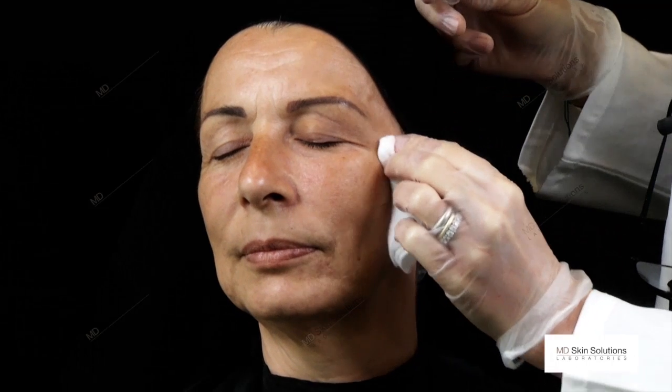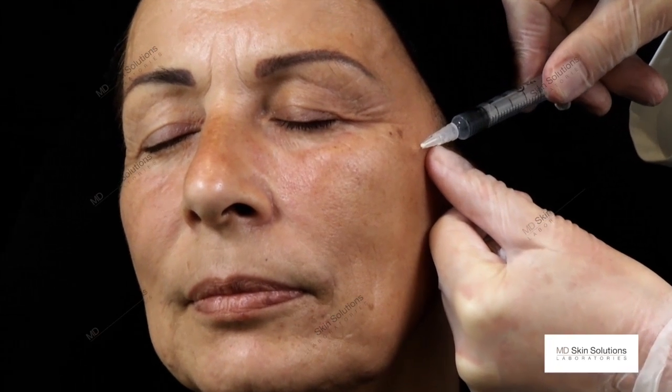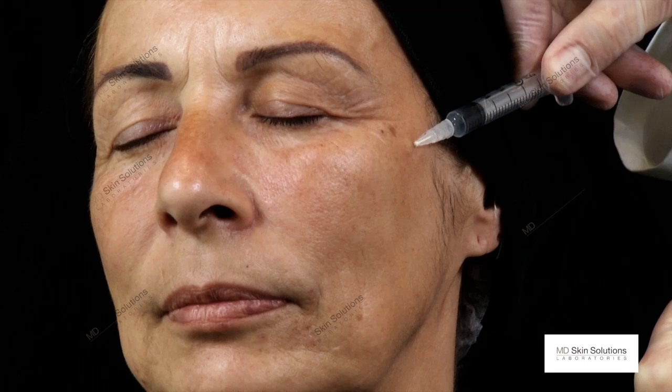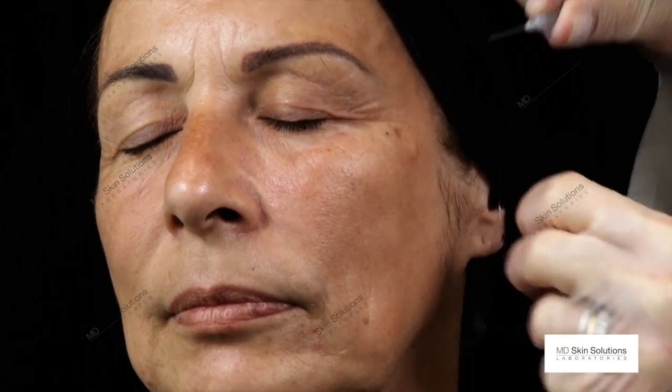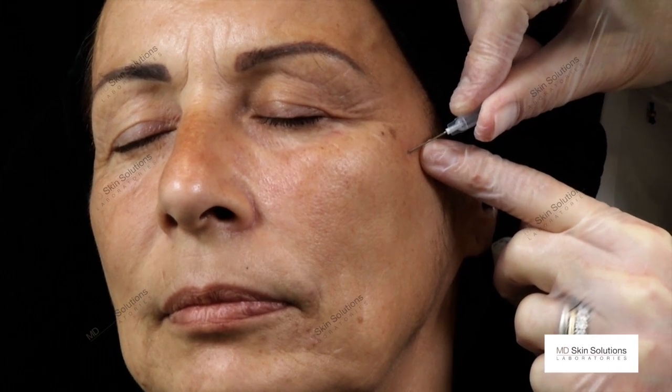To facilitate the procedure for the patient, we will numb the entry point by a little bleb. We will then use a larger needle size to make the entry hole. It's a 23.